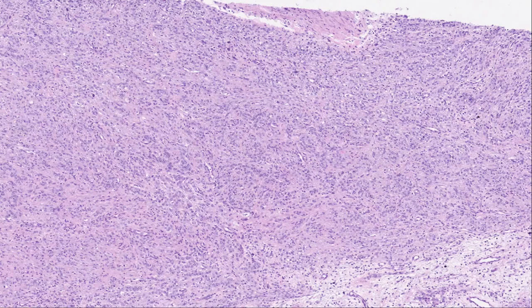Well, by the looks of it, histology sounds like a glorious field. Pathologists most definitely utilize histology as a method of tissue analysis. However, there are important issues that histology cannot overcome with simple tissue handling and staining. When specificity becomes more valuable than simply viewing structures, we rely on immunohistochemistry.